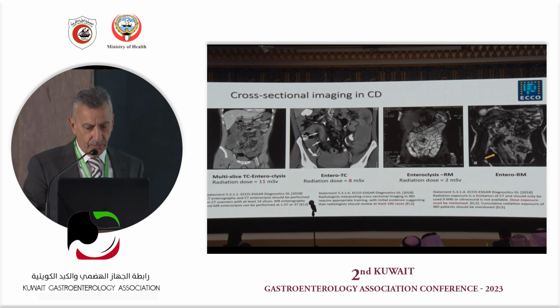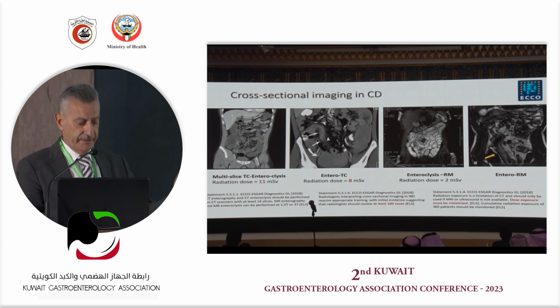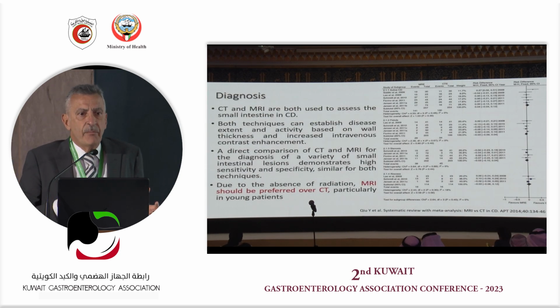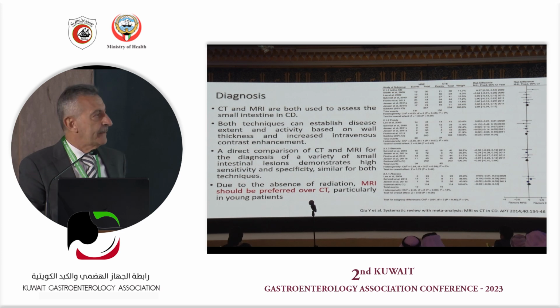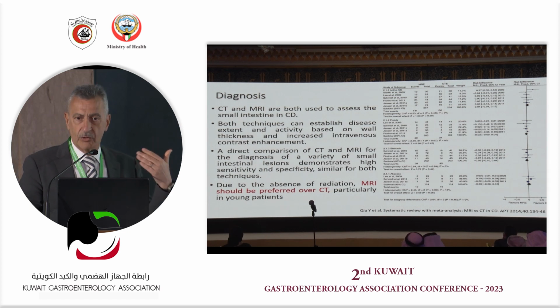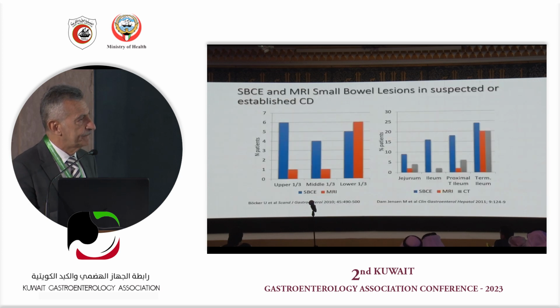And importantly also, in terms of radiation exposure, we have to limit the utilization of CT scan only to emergency or in terms of complication. So what to do is doing better? There is no difference there. You see in this forest plot, there are not many updates in the literature because the methodologies are quite established there. You see in terms of evaluation of activity, evaluation of complication, not quite a difference if you compare the CT with the MRI.